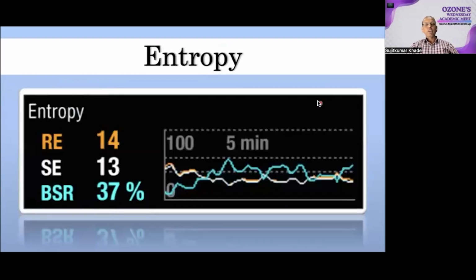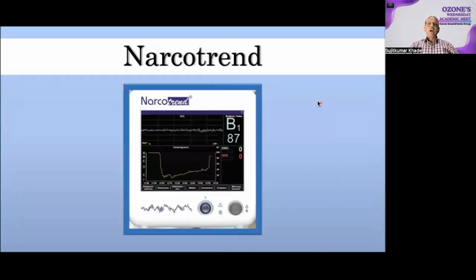The state entropy represents the hypnotic level of the patient and reflects the degree of unconsciousness induced by anesthetic drugs, while response entropy reflects the response to noxious stimuli, including upper facial electromyography. The Narcotrend is an EEG monitor designed to measure the depth of anesthesia and sedation during surgical procedures as well as in the intensive care unit. It works by automatically classifying the EEG signals to determine the patient's level of hypnosis.